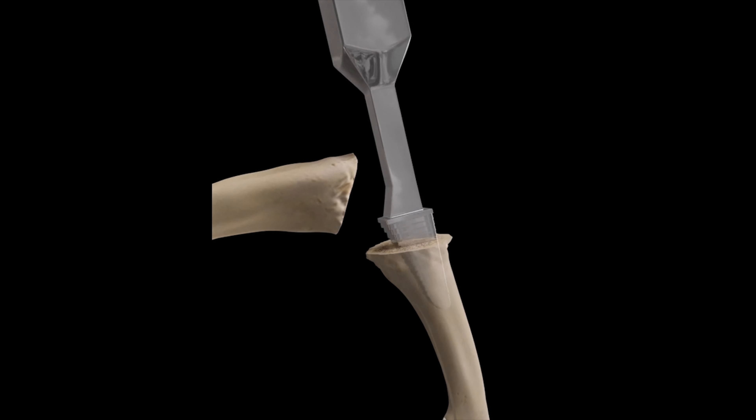The surgeon will make an incision along the dorsal surface of the hand to expose the damaged MCP joint. Damaged articular surface on the bones is removed, and drills and broaches are used to widen channels in the bones for the silicone prosthesis.